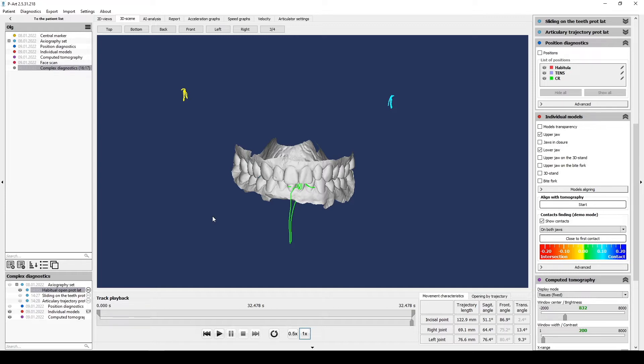First of all, we need to record mouth opening and closing, protrusion, left and right lateral trusion.